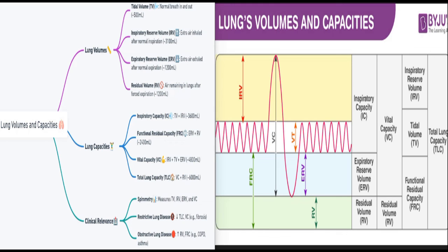For lung volume measurements, for example total lung capacity or FRC, body box plethysmography can be used. Gas dilution methods like helium dilution or nitrogen washout may also be used in cases of mixed obstructive and restrictive conditions.